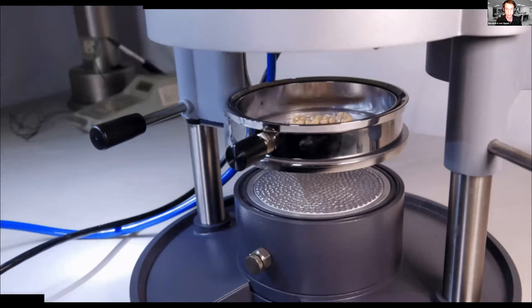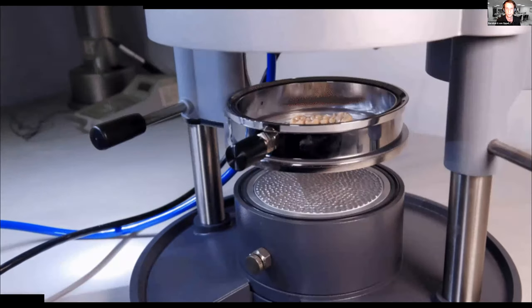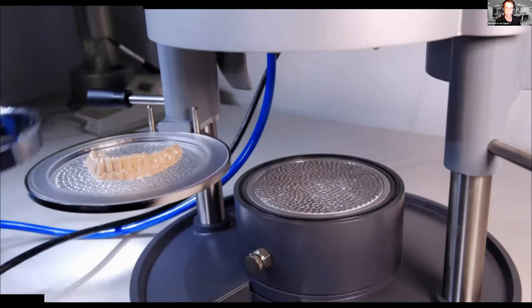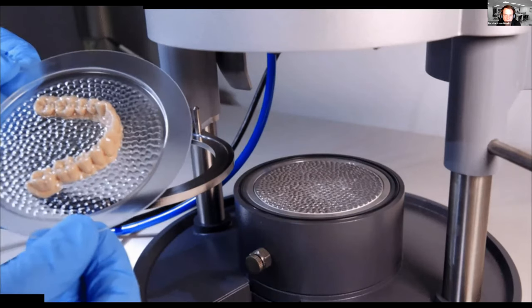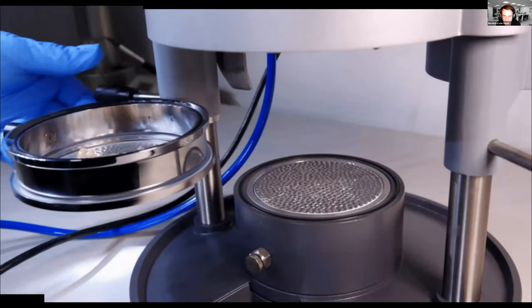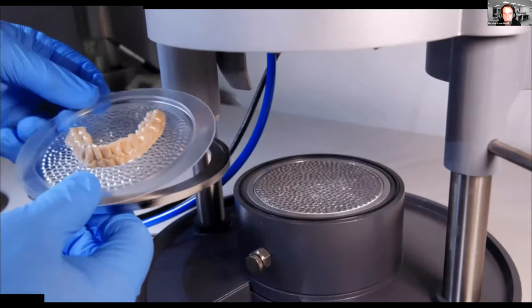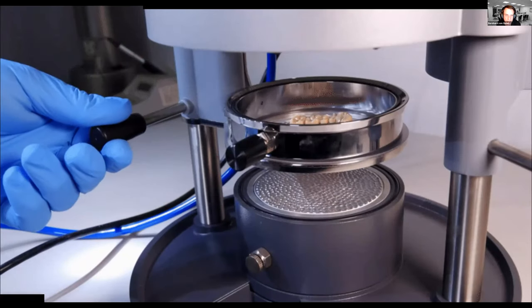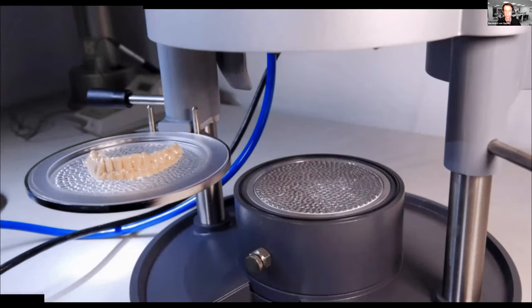In this step, it gets stretched. That's why the final thickness of the aligner is less than the sheet was originally. And you now have to remove the model with the plastic sheet from the machine to finish it. If you have undercuts in the model, it will be a little more difficult to remove the actual aligner from the model. But this is not a big issue, because aligner sheets are very thin and very flexible most of the time. Some machines also use steel granulate to embed the model, and this granulate tends to stick on the thermoformed sheet. You will also need to remove it.